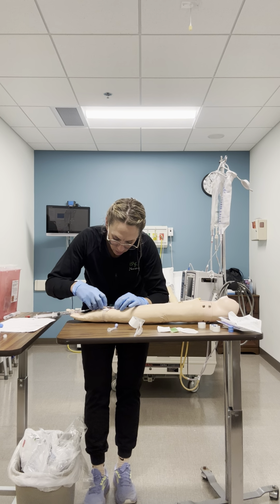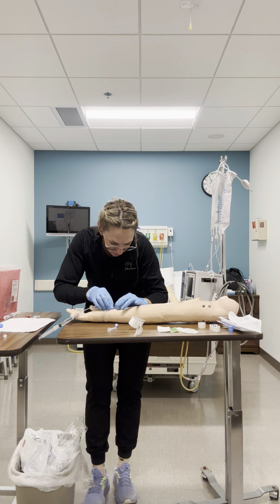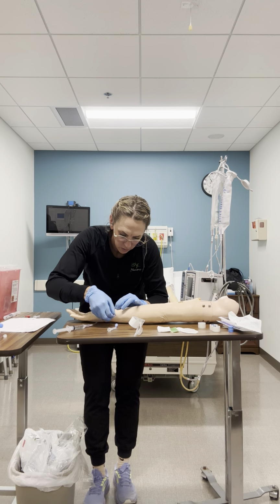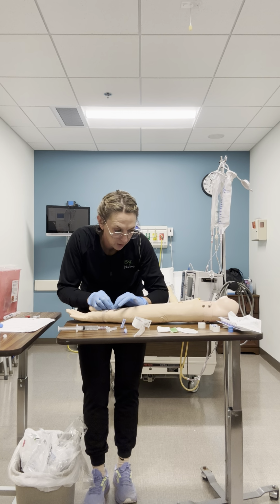I'm going to clip again. I'm looking for signs of infiltration. I don't see any. It looks very good. Everything looks good. It's exciting. Put that lid back on. Okay. Oops, it looks good. I'm still stabilizing my hub.